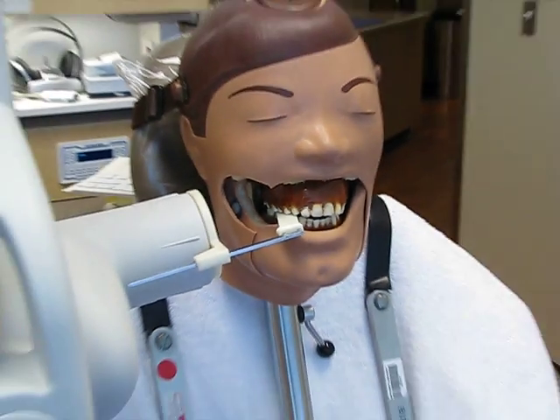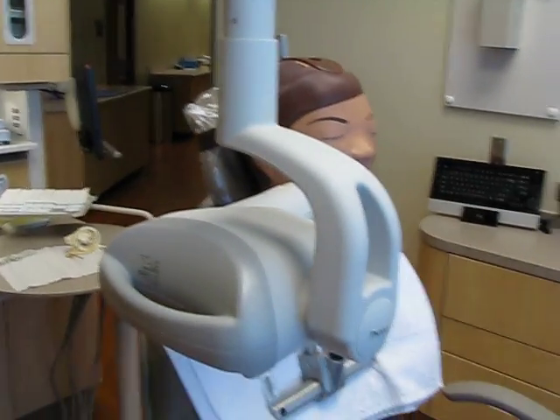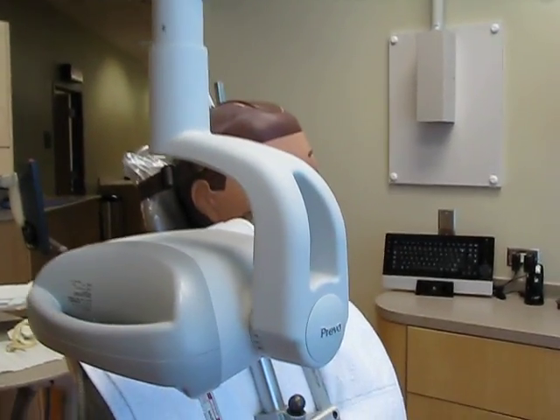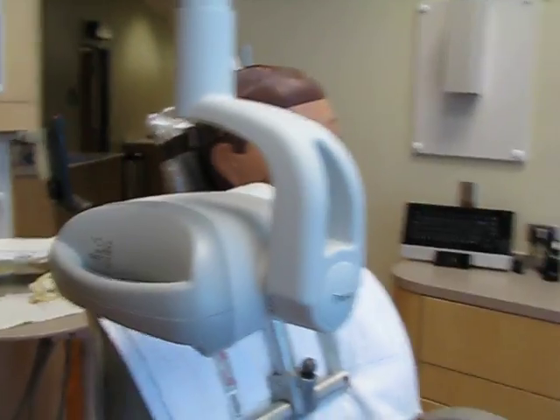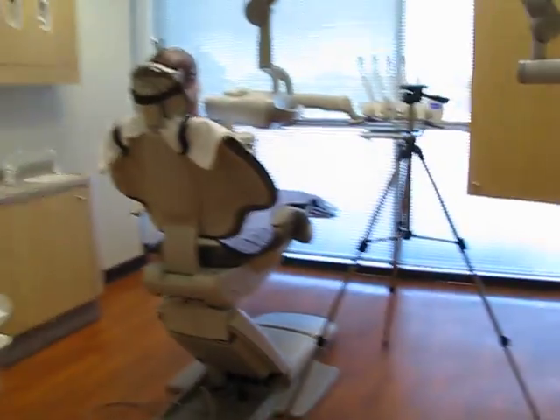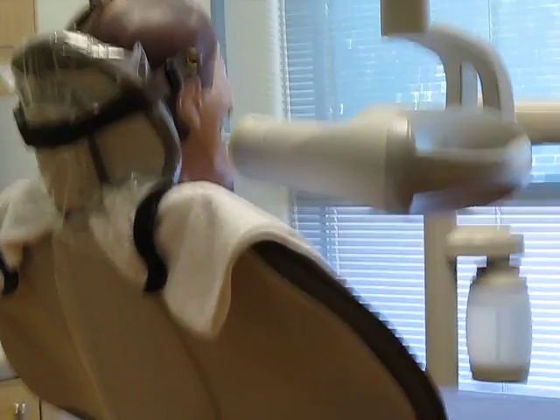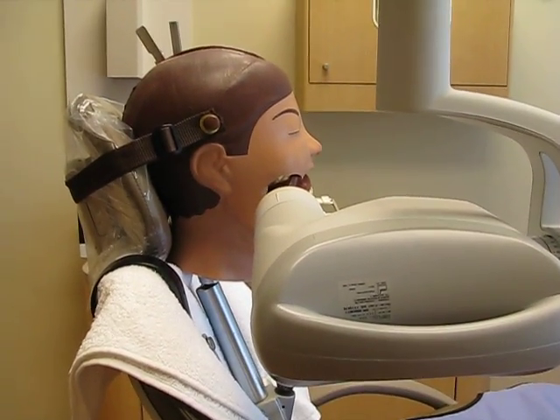Okay? Once we have this, we already had our machine set. We come over to the exposure button and we're ready to take this x-ray. And we will come over here, let you see how it sounds. Step out of the room. Okay, we've come back. We've now taken this x-ray and we can process it.